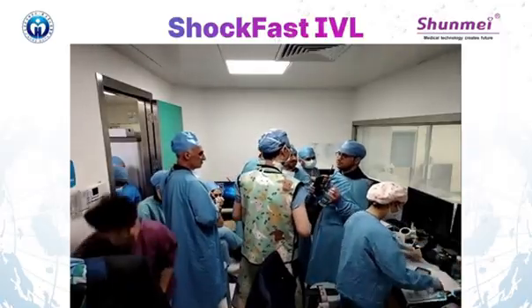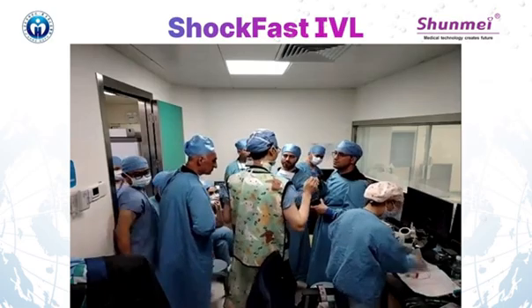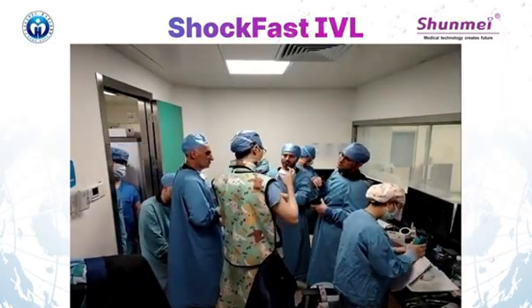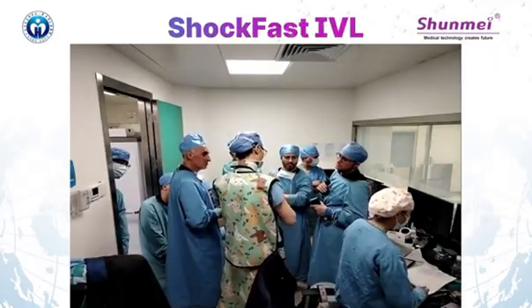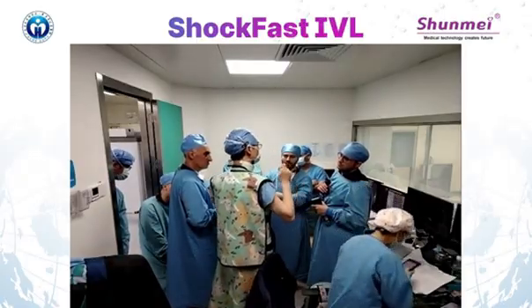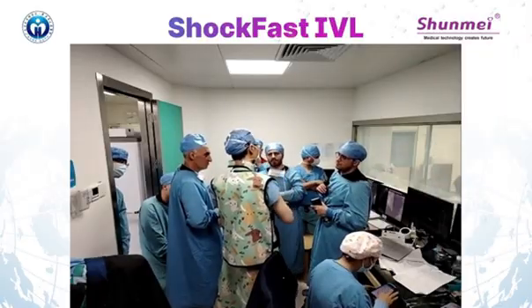Choosing the IVL balloon size: I chose it according to the reference vessel. There's a compromise between the reference vessel and the lumen diameter, because at that place it's very narrow.